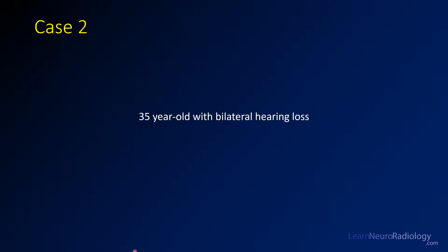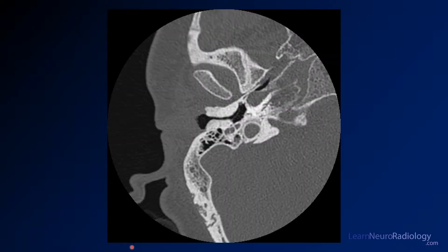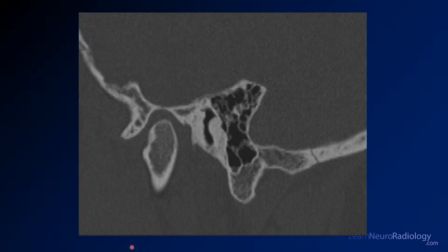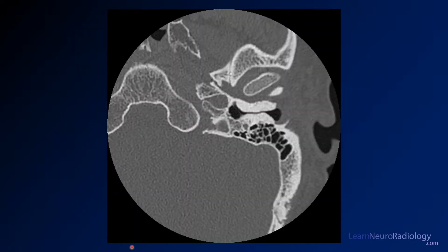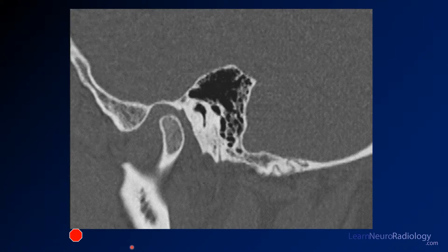For the second case we have a 35-year-old with bilateral hearing loss. Here we have an image from a CT of the temporal bones through the right temporal bone. This is a sagittal image also through that right temporal bone. Now an axial image from the contralateral side, and the corresponding sagittal image. Take a look at those images and come up with your differential diagnosis.